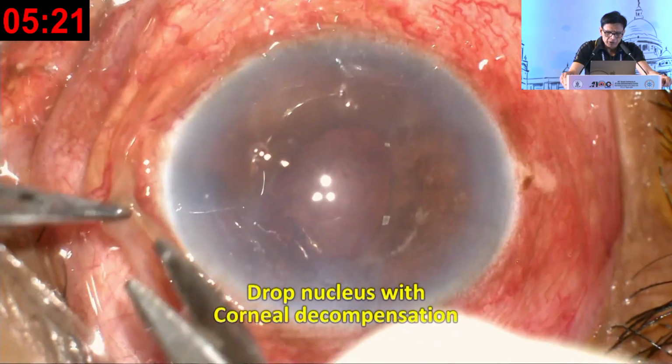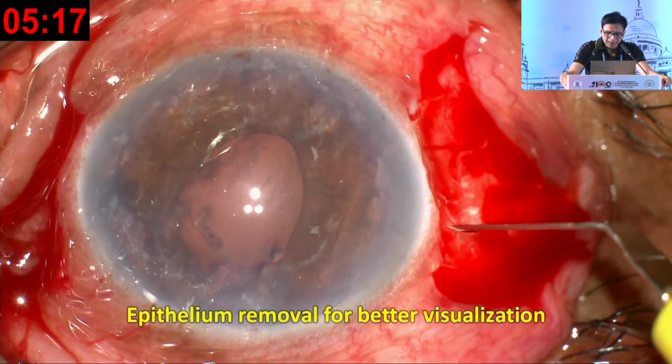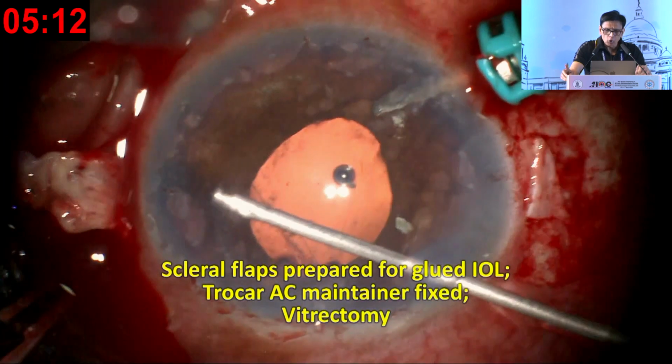So I now go inside and I make my flaps. Before that, I take off my epithelium to see better. Once my flaps are made, I am fixing a trocar AC maintainer. If you see that trocar is going in above the iris.